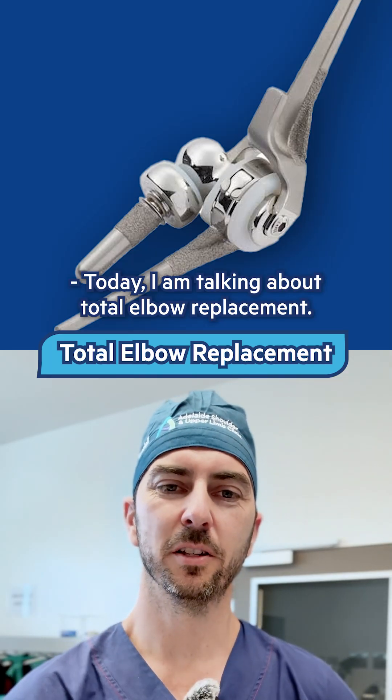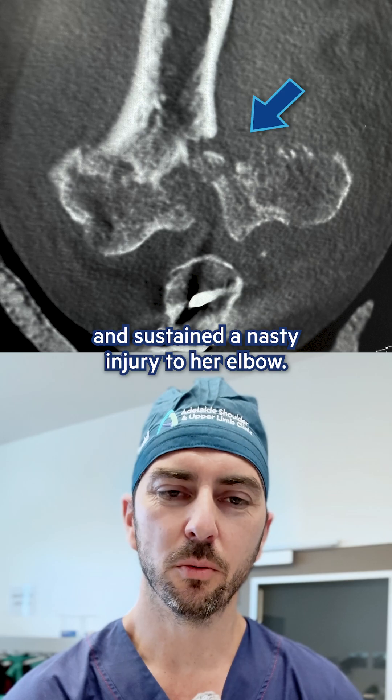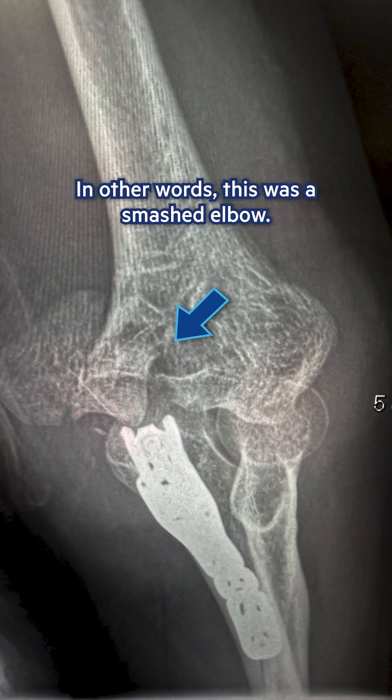Today I'm talking about total elbow replacement. This elderly patient had a fall and sustained a nasty injury to her elbow. X-rays and CTs confirmed that there were multiple fragments — in other words, this was a smashed elbow.